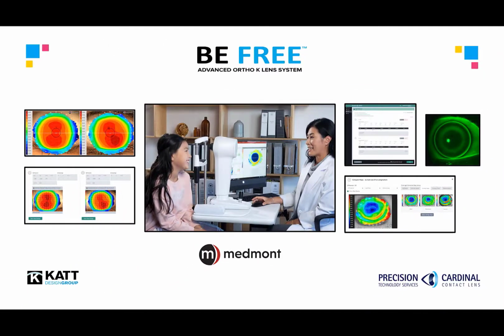The Medmont is not only the best tool for BE FREE treatment, it's also a world-class imaging tool with white light, fluorescein, and a full suite of dry eye testing and analysis displays. Speak to the Precision and Cardinal team about options and access to this amazing instrument, which will improve your BE FREE and orthokeratology success, but also offer the practice expanded testing, diagnosis, and patient education tools.